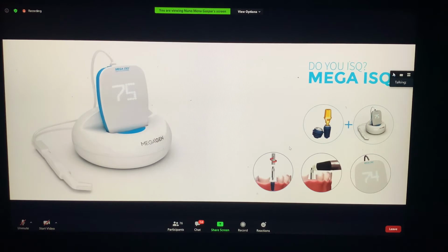We use a Smartpeg screwed over your implants.